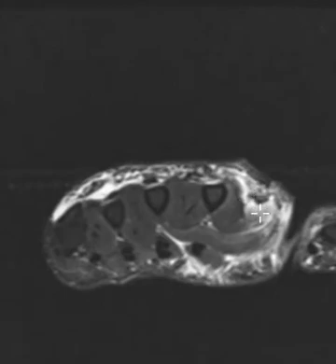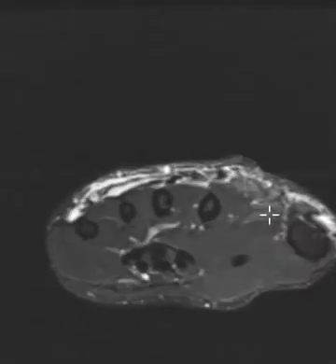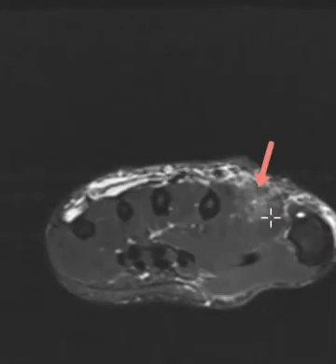So we answered their question — there's no extensor tendon rupture or laceration — but they have a lot of edema along the dorsal radial aspects here. They do have a significant abnormality right here. We have a tear of this muscle, which I've never seen before. This is the first dorsal interosseous muscle.